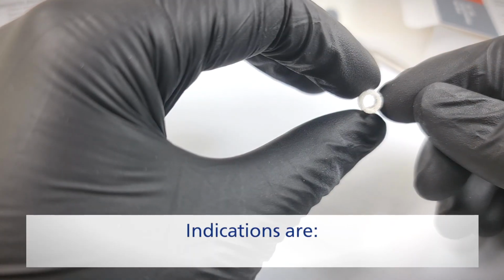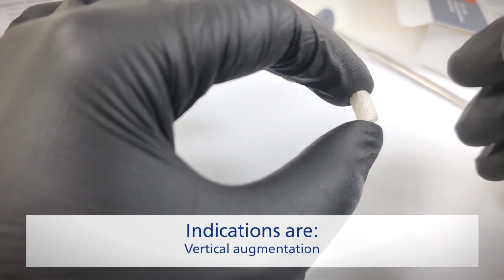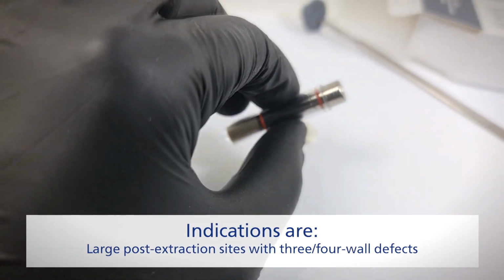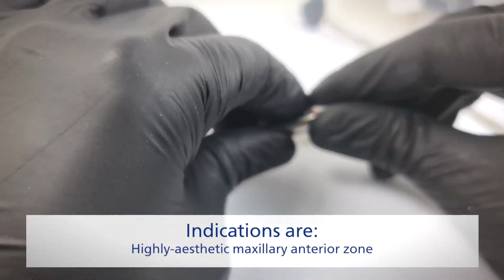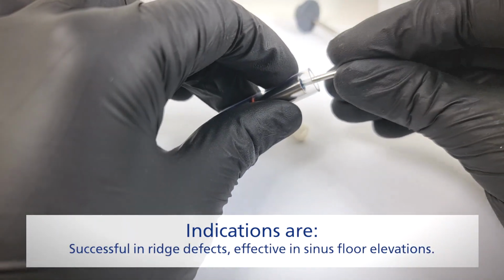It can be applied in a single tooth gap, edentulous space, vertical augmentation, three-dimensional defect, extraction sites, and treatment of periimplantitis with severe bone loss can be made. In addition, the bone ring technique can be used for sinus floor elevation.